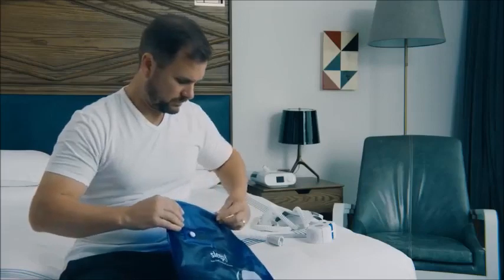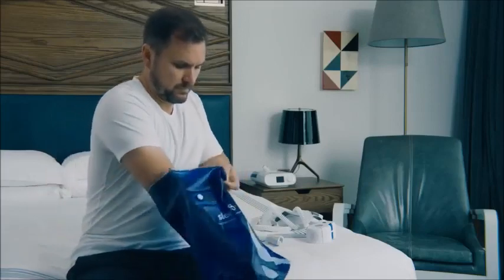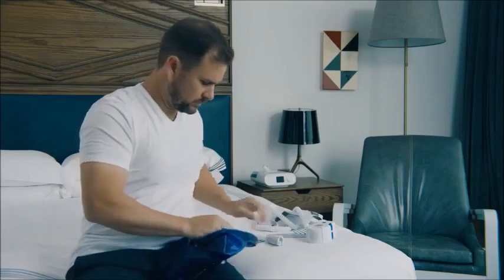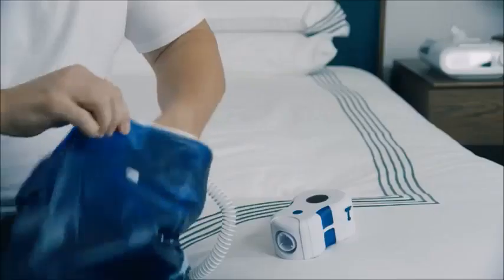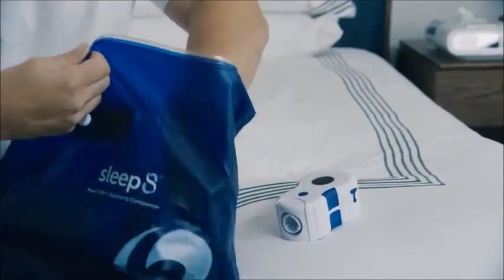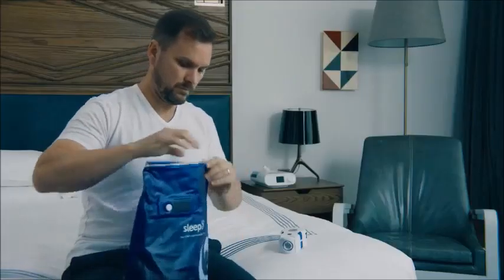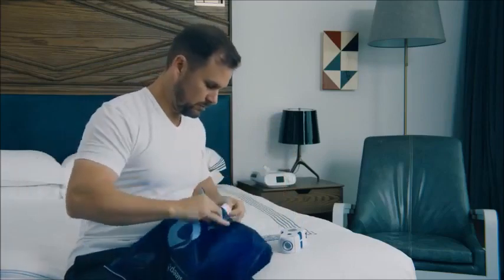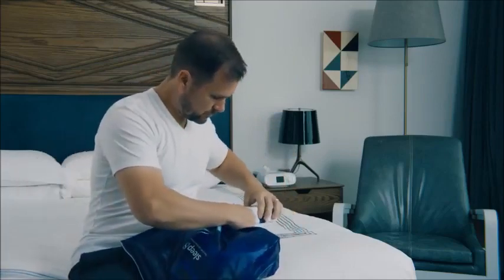First, unzip the bag. Look inside and find the round valve at the bottom. Then detach the tubing from your PAP machine and attach the end of the tubing to the round valve inside the bag. Once it's connected, place your mask, tubing, and empty water chamber in the bag. Zip the bag closed.